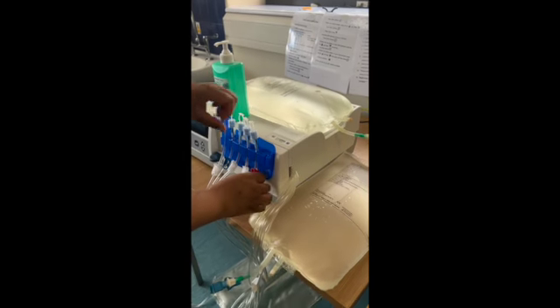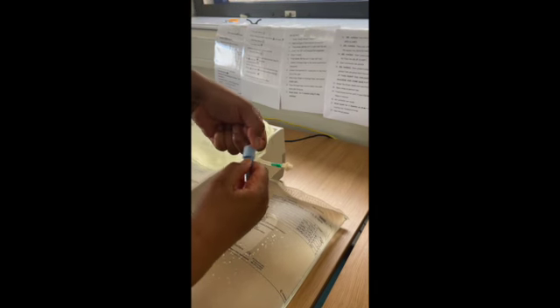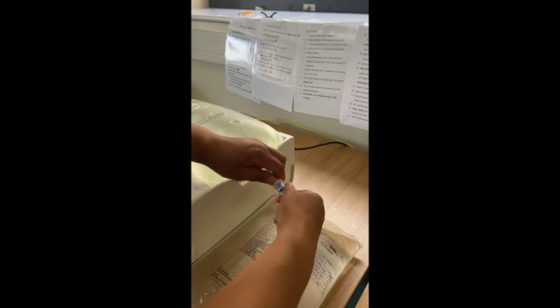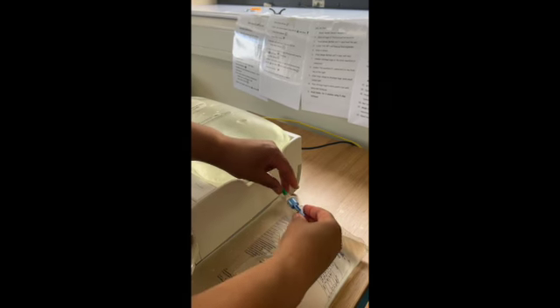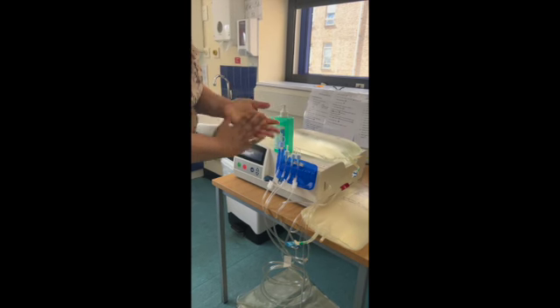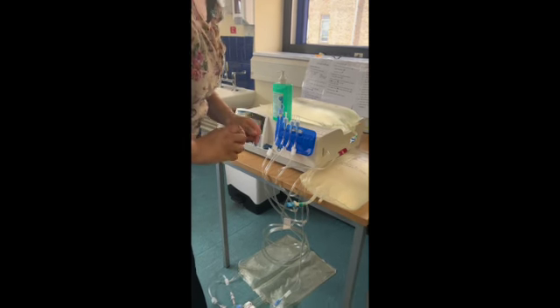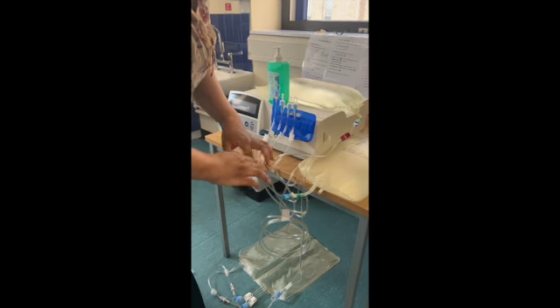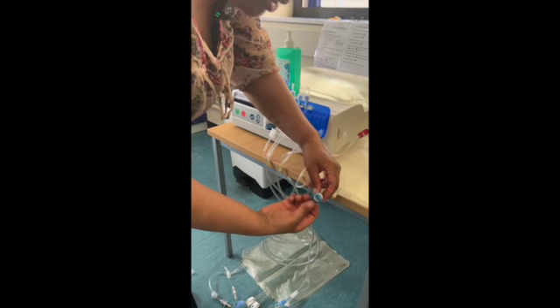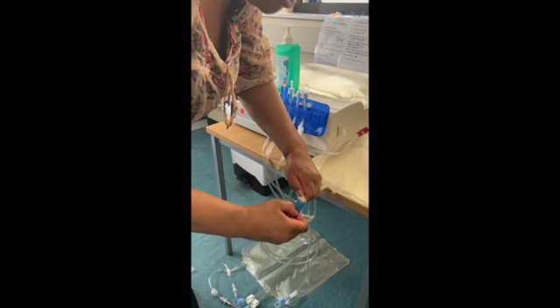And then I connect this to the heater line. Again, being careful not to touch what's on the inside. And then I connect the two together. So I'm going to gel my hands again before I connect my supply line to my supply bag. And again, as before, being very careful to not touch what's on the inside of there, so that there's no risk of infection. So holding the edge, making sure that when I pull it off, I'm not touching what's on the inside.